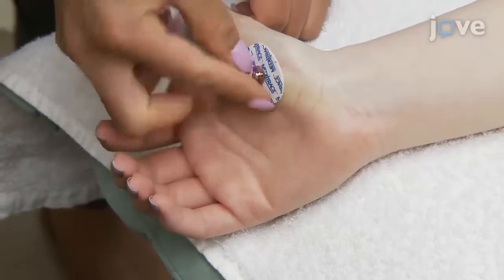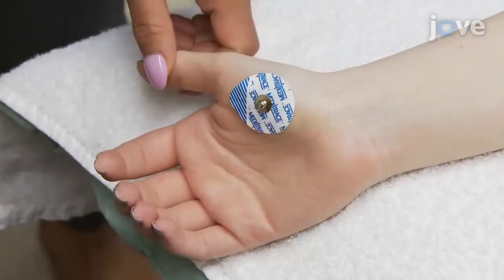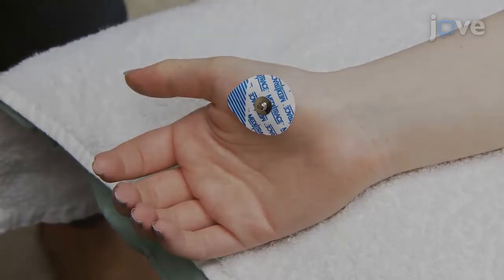Now, place two disposable EMG disc electrodes with a diameter of about 30 mm over the right abductor pollicis brevis.